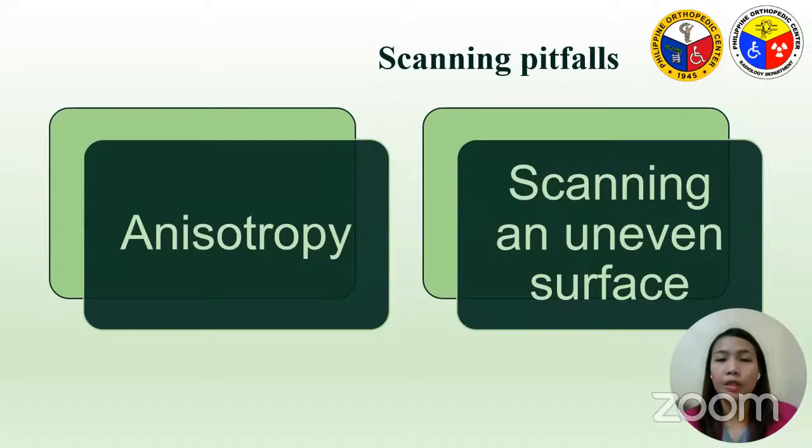Accurate transducer placement is critical for producing high-quality pictures. Poor transducer location or angulation might lead to inadequate visualization of the target structures or introduce artifacts that can be difficult to comprehend. To avoid these difficulties, the sonographer must have adequate training and expertise in shoulder sonography, adhere to standardized protocols, employ dynamic scanning techniques, and interact with doctors to guarantee a thorough evaluation of the shoulder.